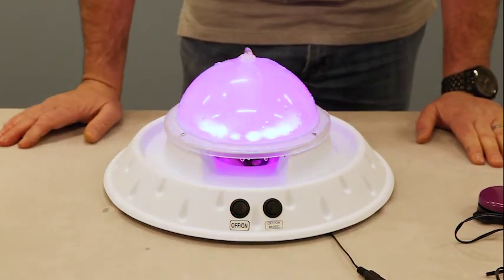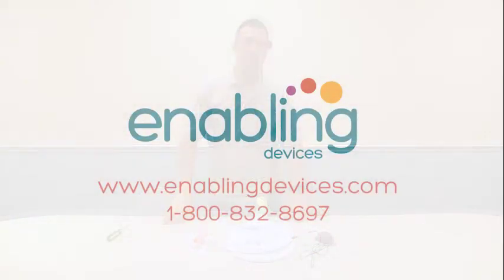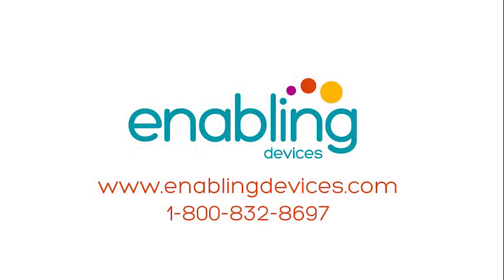When you're done using it, you just need to empty it out, wipe it with a paper towel, and let it air dry. So there you have it — the Aqua Dome, number 1691. You can purchase this item through our website at www.enablingdevices.com or through our phone sales at 1-800-832-8697. Thanks for stopping by, hope you enjoyed the video.